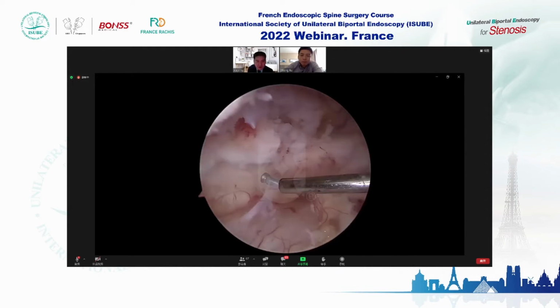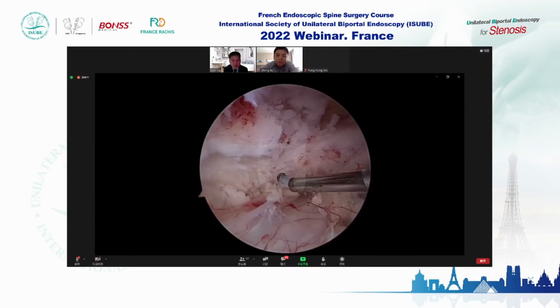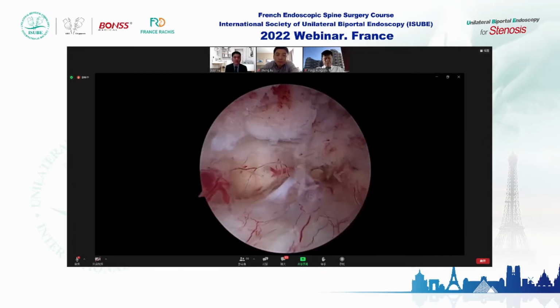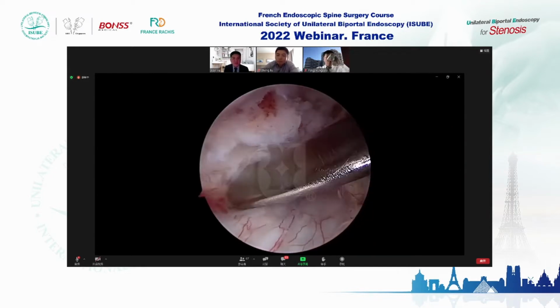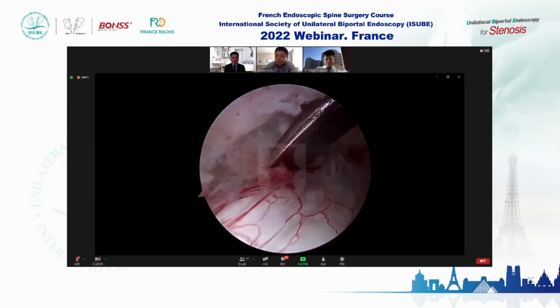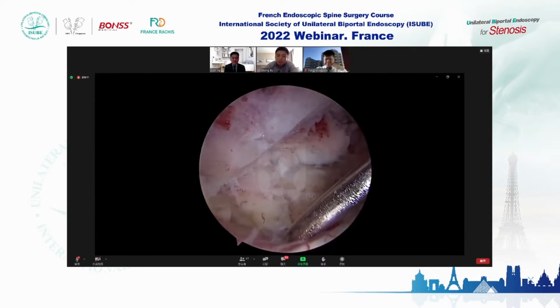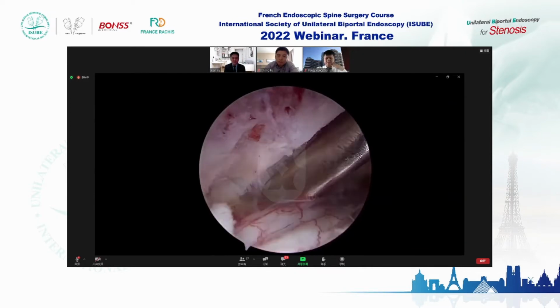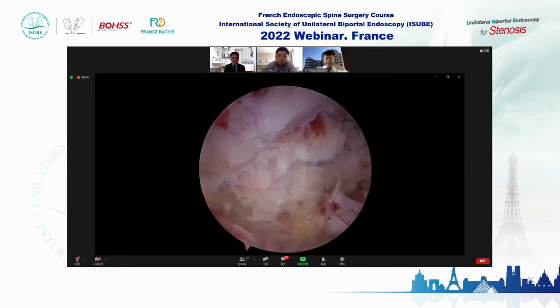So you use the transverse incision or a straight one? 是直的纵切口还是横切口？你是横切口是吧？横切口的啊。我们剥离一下，来寻找一下这个中央型的突出。Maybe this is the central disc herniation.